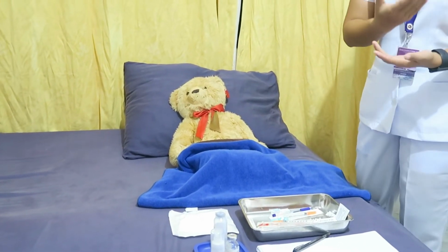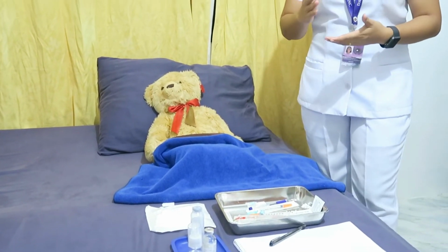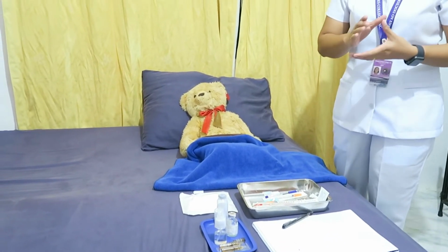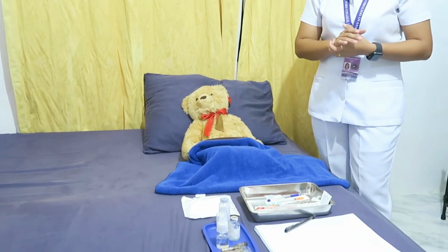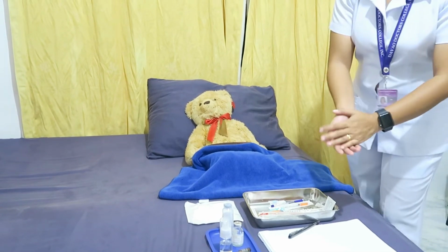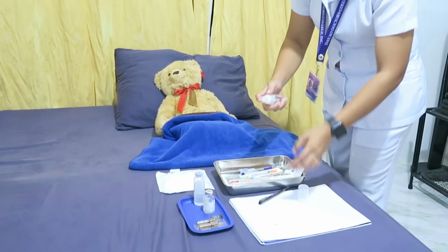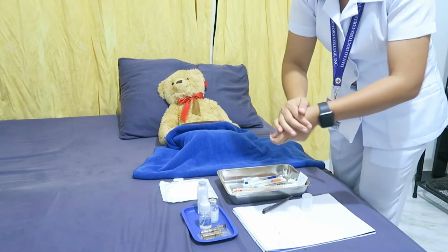So, do aftercare. Remove the gloves. Dispose of used items in appropriate waste receptacles. So, return other equipment and perform hand hygiene. This is to prevent loss and deter the spread of microorganisms. So, let's assume that I will remove my gloves. And after that, perform hand hygiene. Again, this is to deter the spread of microorganisms.